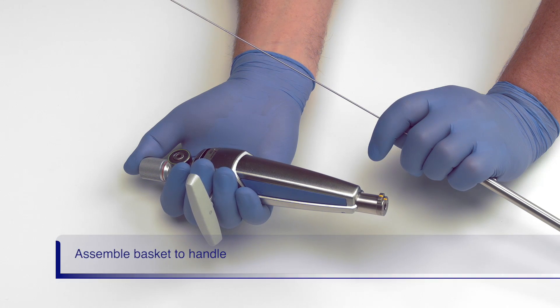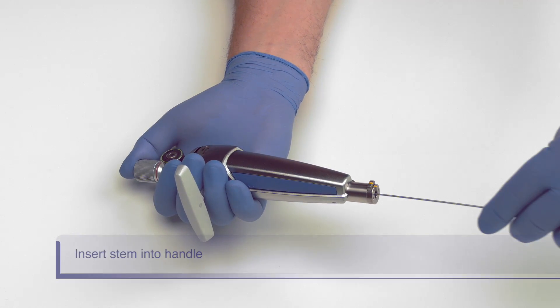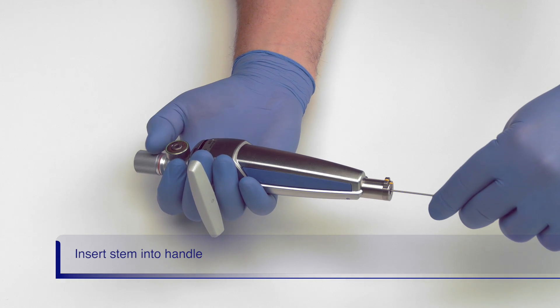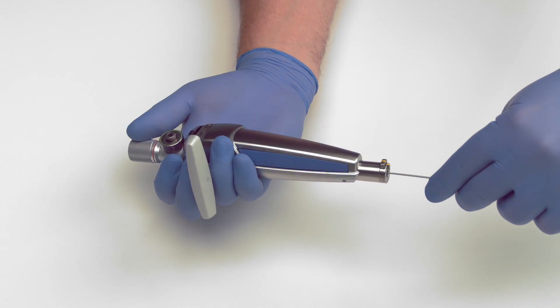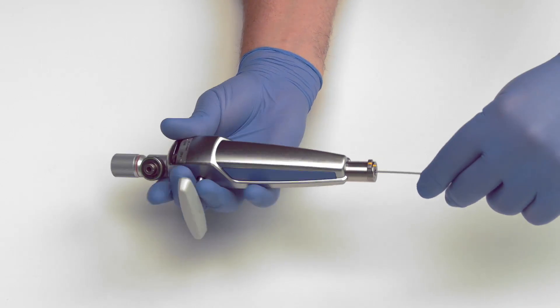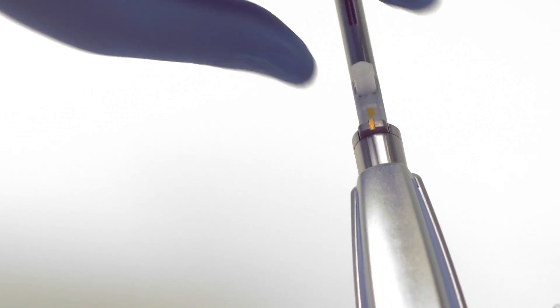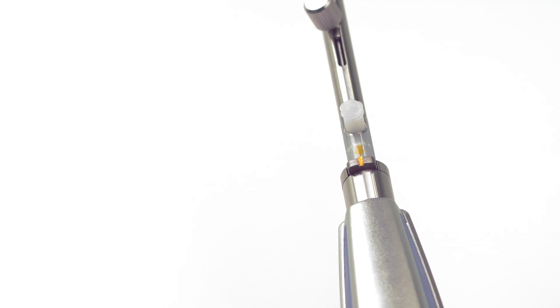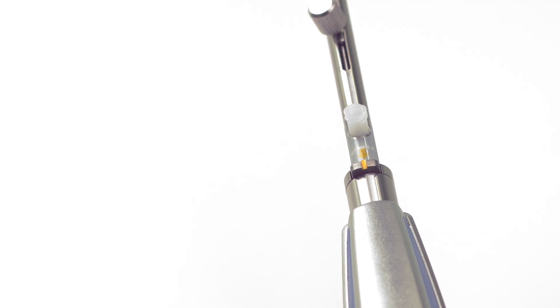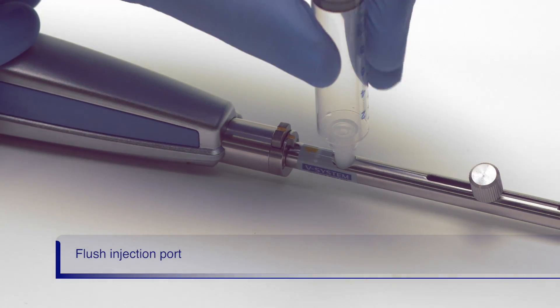Next, we will assemble the basket to the handle. First, insert the stem into the handle until you feel or hear a click. Lock the stem in place by fully turning the knob on the release button clockwise. Next, align the yellow arrow on the end of the basket to the yellow marks on the handle. Push the basket end into the handle until you feel or hear a click. Flush the injection port prior to passing the basket into the scope.